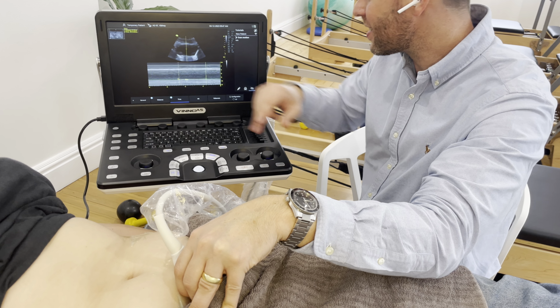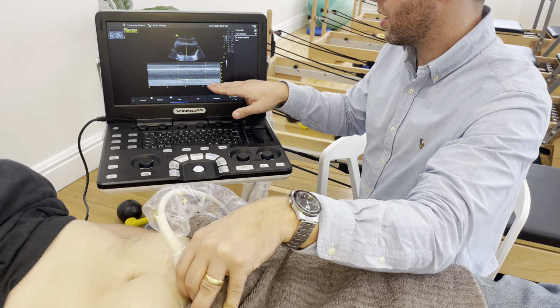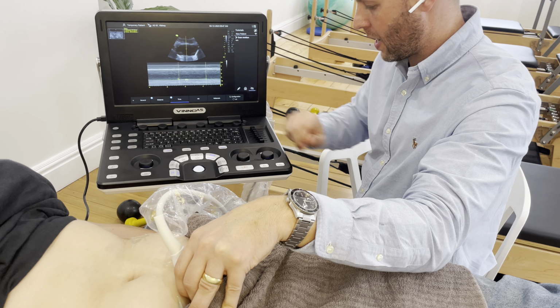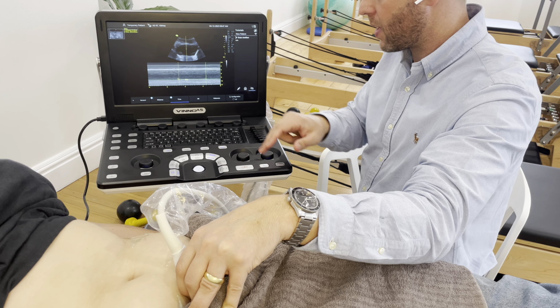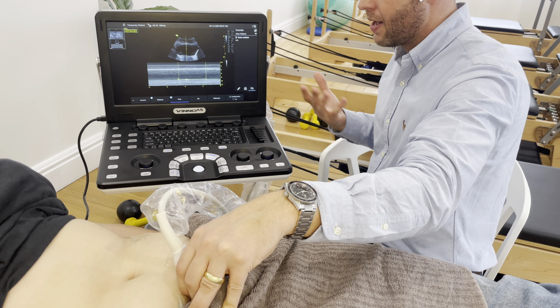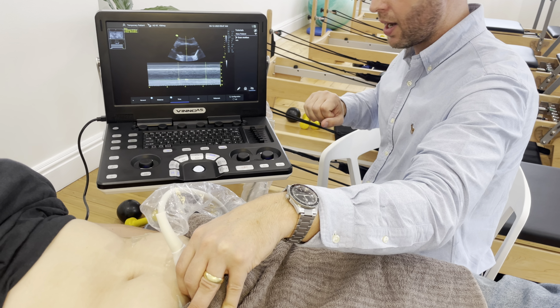We could probably change the unit of measurement up there. So we know that we were able to hold a contraction 0.34 centimeters and for about 3 seconds. So I'm going to press P1. That's going to save it for me, and that's going to be in the patient's file. So that's a way that we can get a really nice snapshot of exactly what's happening with the pelvic floor.